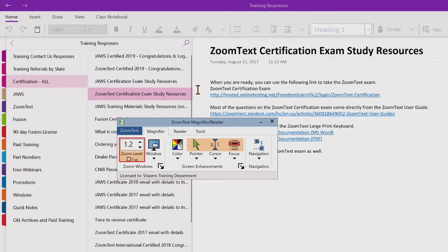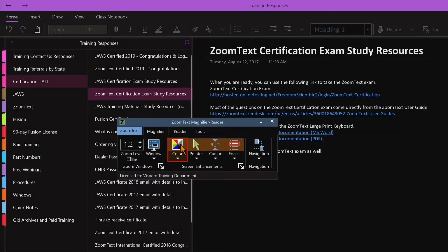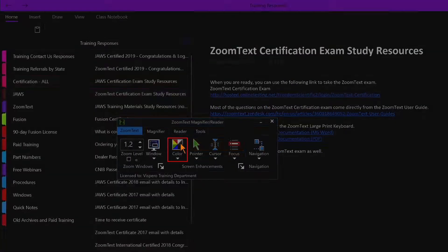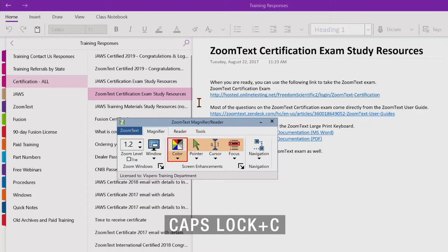To toggle the color enhancements on and off, do one of the following. On the magnifier toolbar tab, select the color button to toggle color enhancements enabled or disabled. Or press the color enhancement toggle keystroke, Caps Lock C.